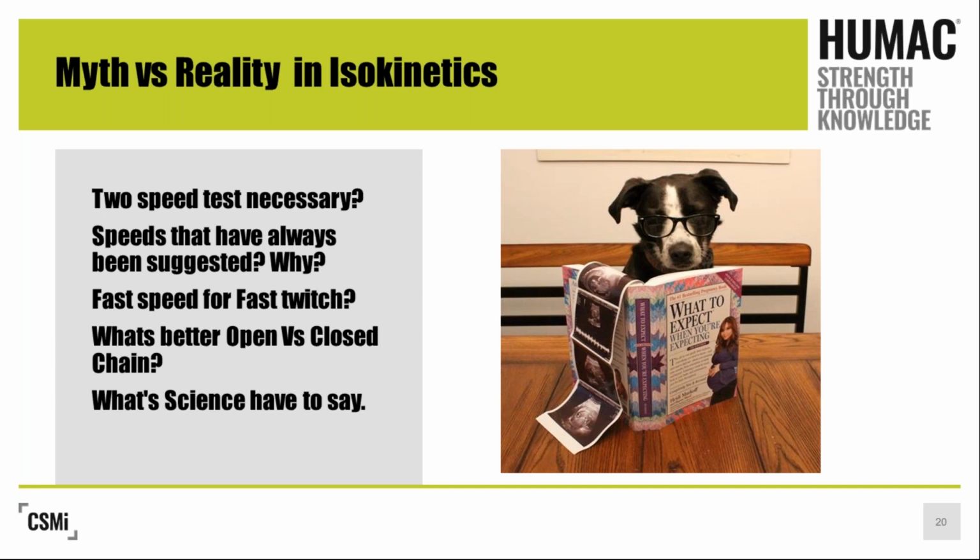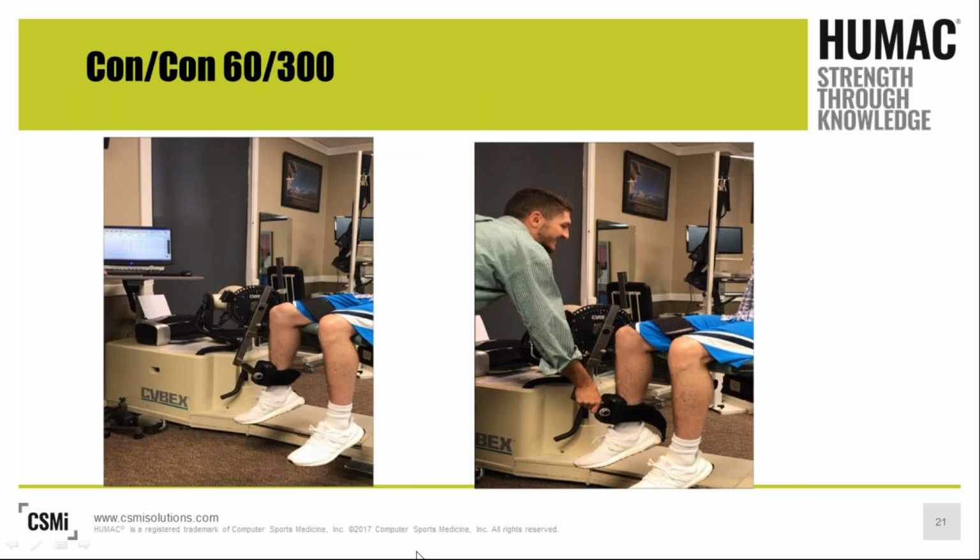And then again, there was the whole concept regarding open versus closed kinetic chain. And I really want to mention that as we go on. I want to look at what science has to say, because I think it becomes important for us to look at that evidence-based research.